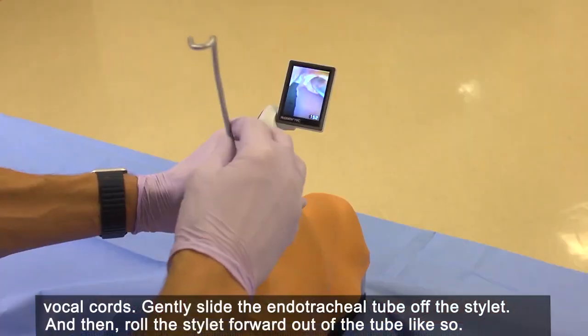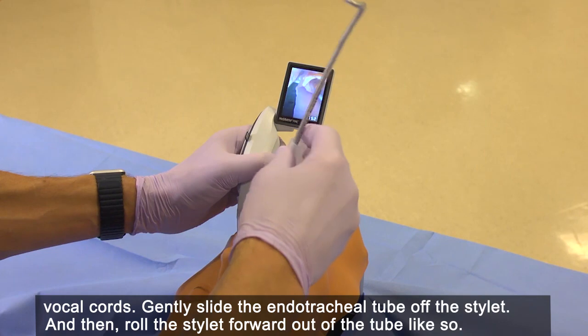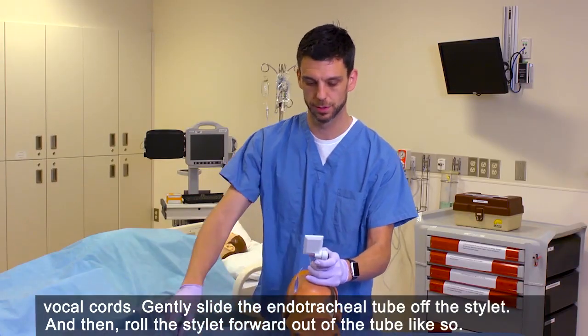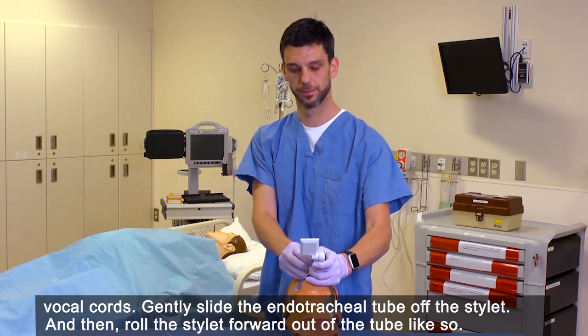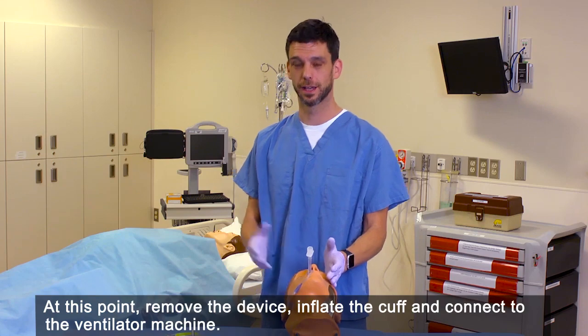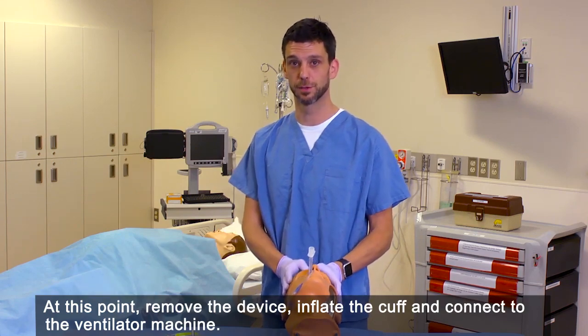Gently slide the endotracheal tube off the stylet and then roll the stylet forward out of the tube. At this point, remove the device, inflate the cuff, and connect to the ventilator machine.